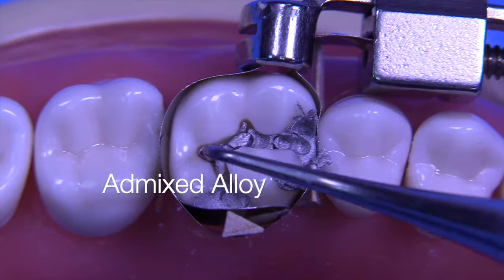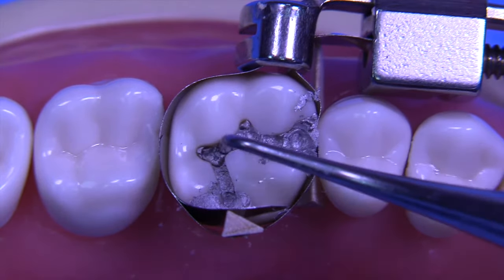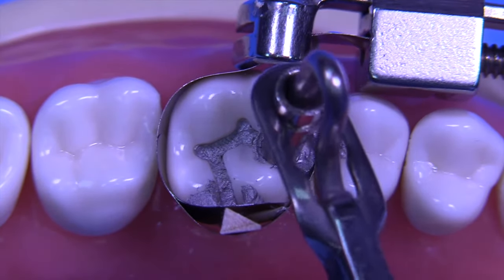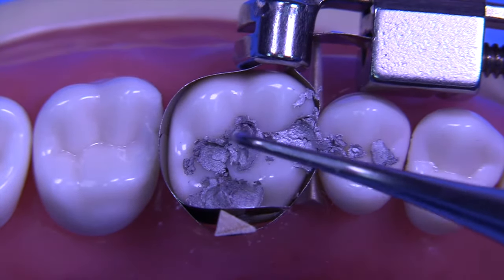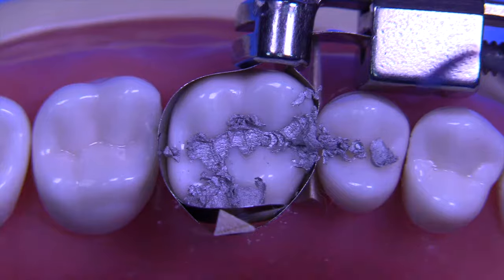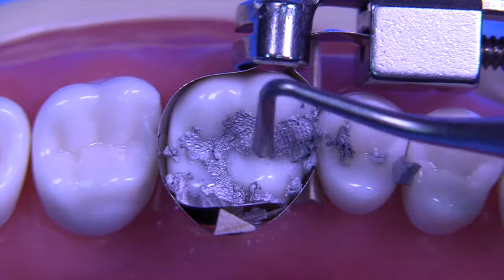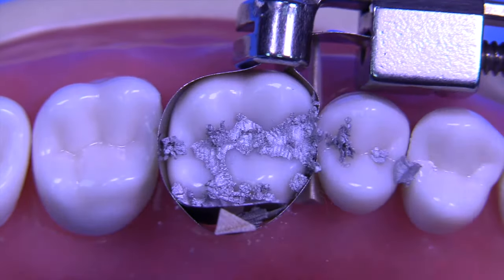Today we're going to utilize an admixed alloy. This amalgam is being placed with a small condenser, and we're going to use the condenser with a fair amount of force to make sure that we've adapted the amalgam really well to all of the walls — not only the horizontal walls, but also the vertical walls. We use the amalgam carrier to keep adding more amalgam because we're going to add more than we actually need. This is really important — to overfill the cavity so that we can burnish the areas adjacent to the finish line. We're also utilizing a Hollenbeck carver and then moving to a medium or large condenser if necessary.